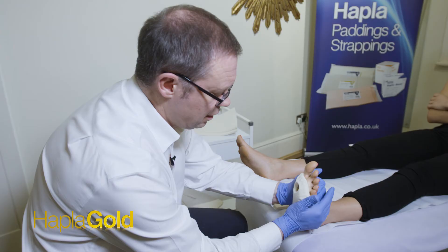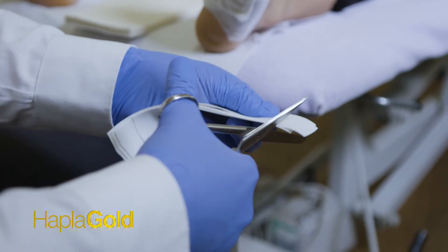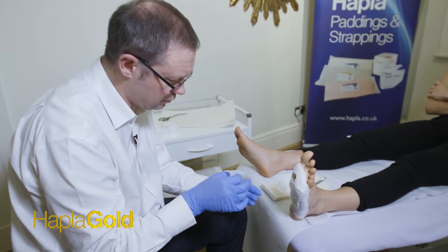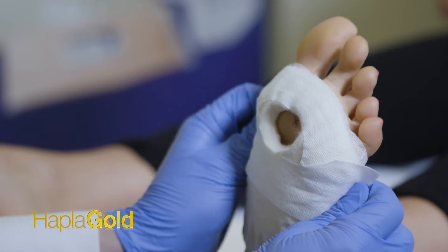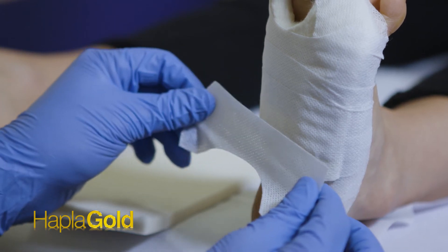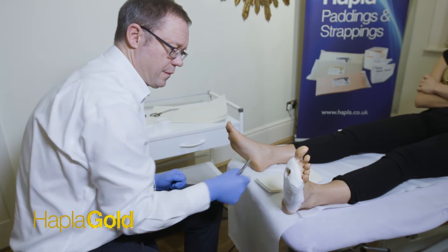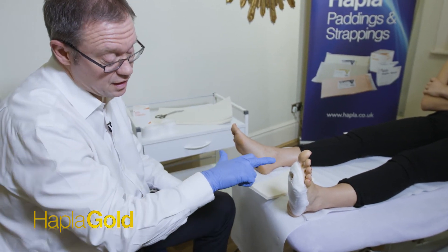This too will be secured with retentive strapping, again with curved ends. That's our plantar slab.